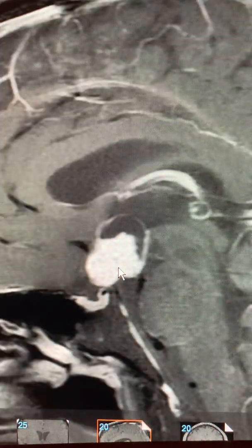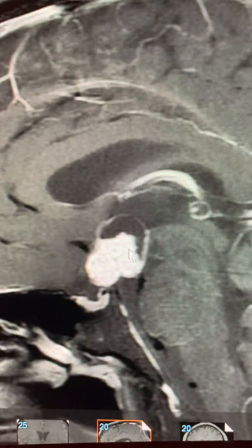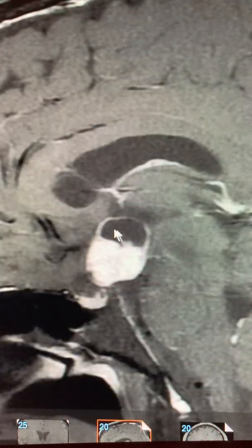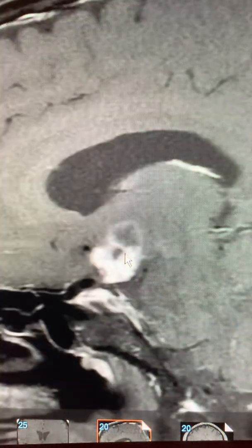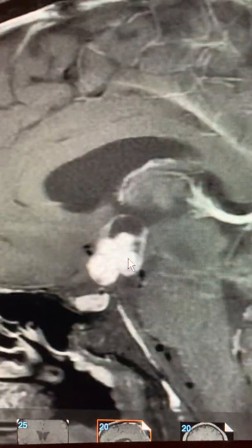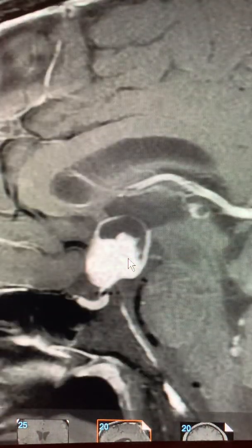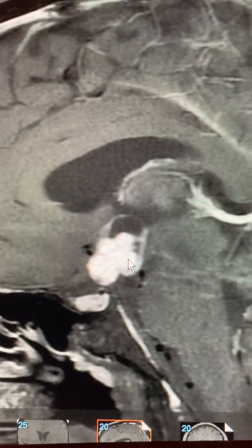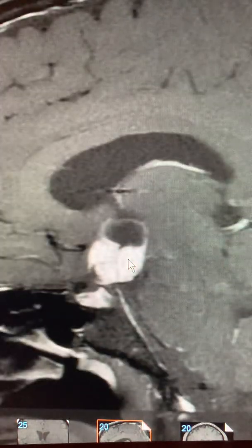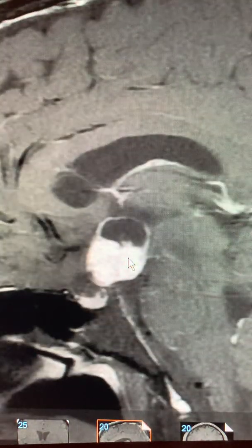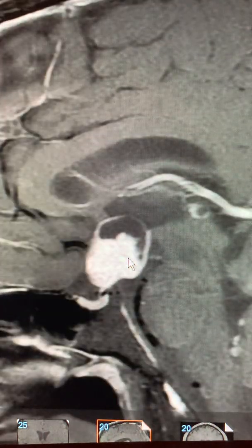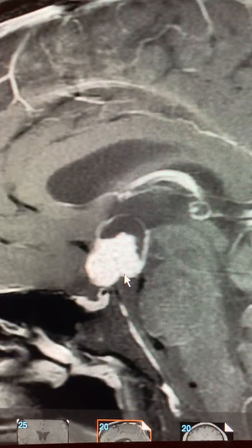This patient is pan-hypopituitary with diabetes insipidus. Again, solid bright enhancement and cystic parts of this lesion as well. This is a classic craniopharyngioma — classic in appearance, no doubt about it. Until proven otherwise, it's a craniopharyngioma. This could be a pilocytic astrocytoma, but I seriously doubt that. Surgery will tell for sure, but until proven otherwise, this is a craniopharyngioma.